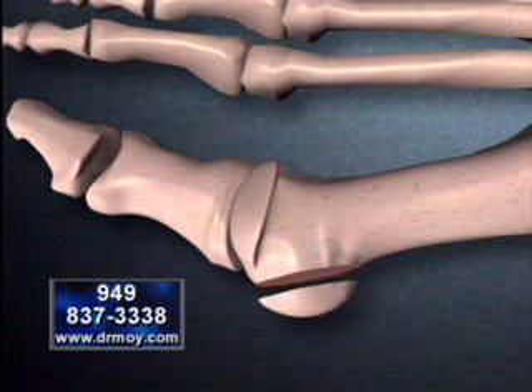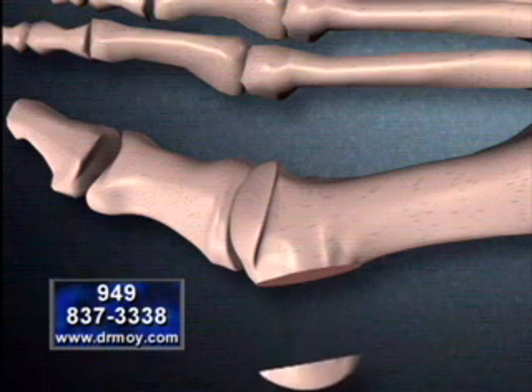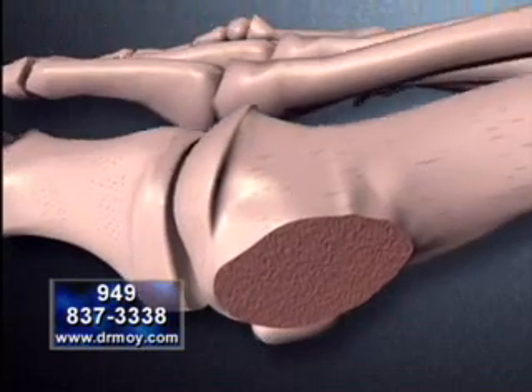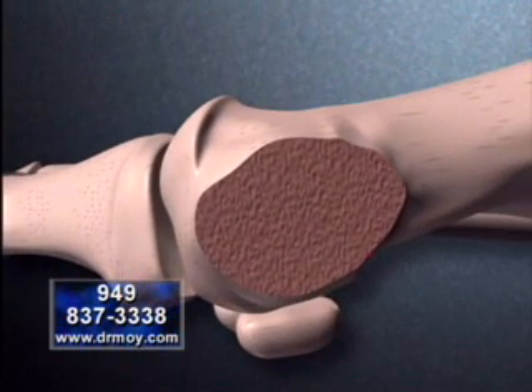We must now realign the great toe joint to prevent the bunion from growing back. Now, looking underneath the great toe joint, we see two very small sesamoid bones.